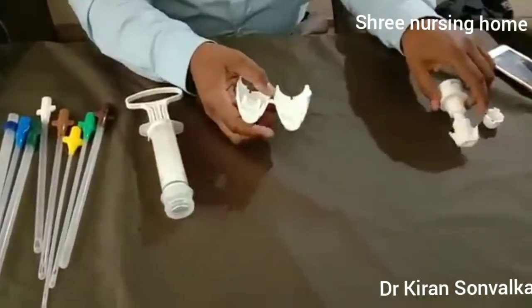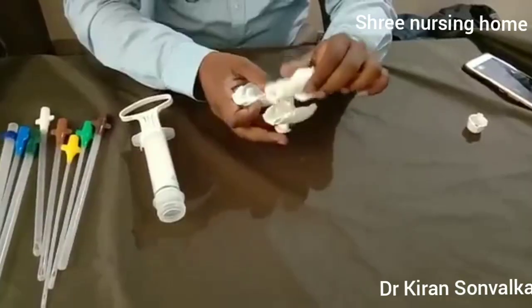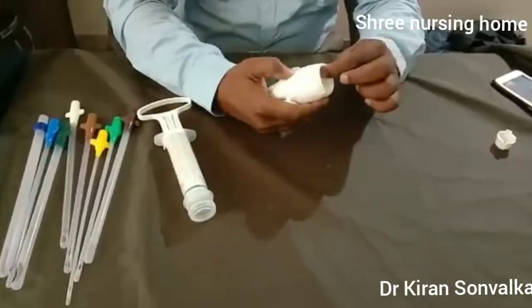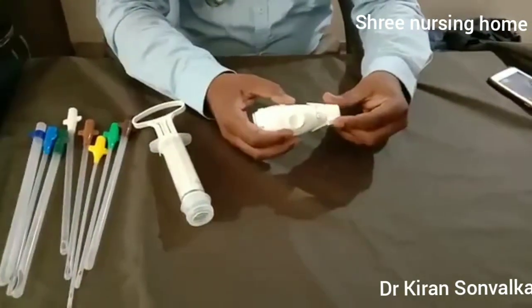Now regarding the valve: this is the plastic covering of the valve and this is the inner liner of the valve. Put the liner inside the valve and close it and fix it. This is the cap — we are putting the cap on it.